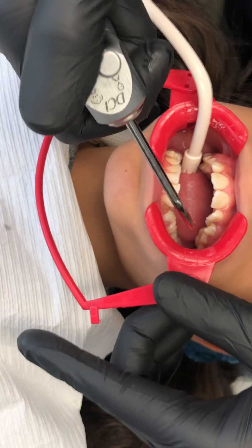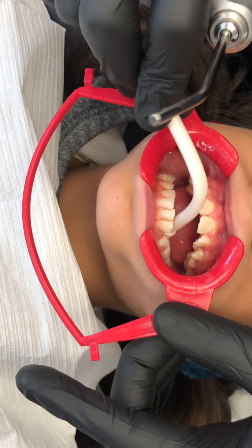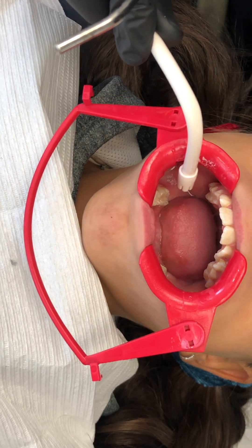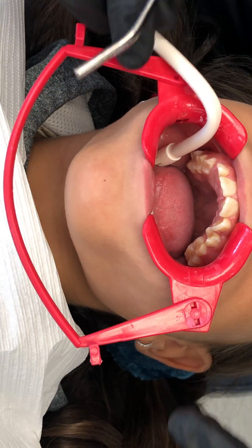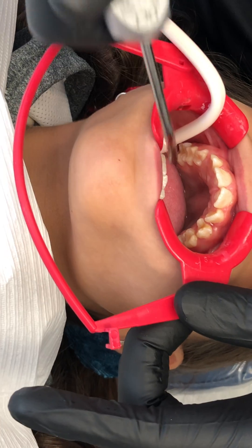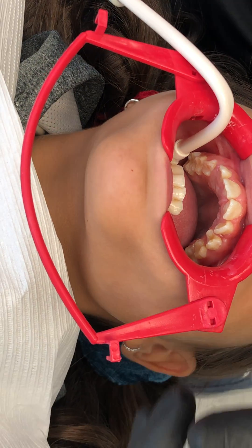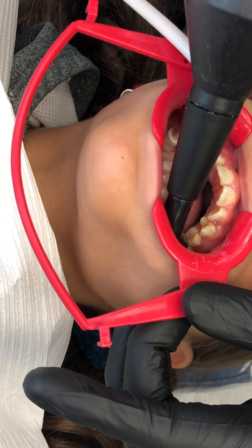Alternatively, if you have a tough patient to manage, you can use the full Nola and put the tongue guard in there if you like — most of the time we don't find it necessary. We're going to dry the teeth now with air.